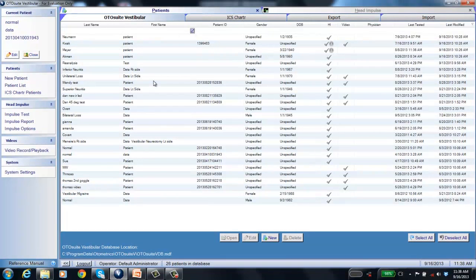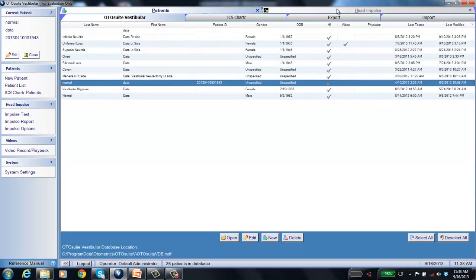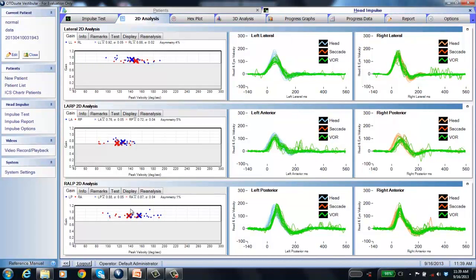Now in the OtoSweep vestibular software used with the ICS Impulse, let's look at patient data. Searching for demo data with first name 'data,' let's start with a normal result. Going to head impulse: the first thing to look for is are there catch-up saccades? We don't see any red spikes, so no catch-up saccades are present — they're within normal limits. Looking at the gains, all are in the white region — within normal limits.